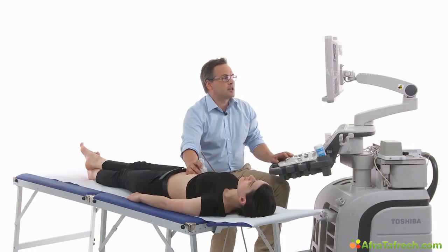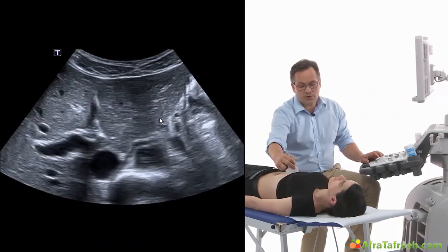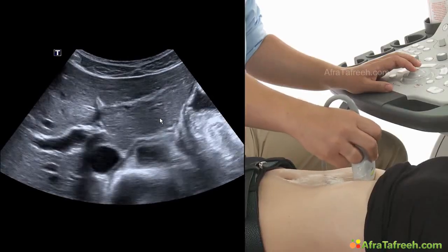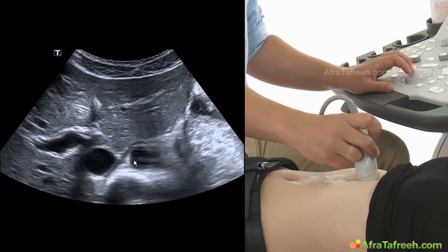After we manage to scan the aorta in the longitudinal scan, we change to the transverse view in the epigastrium, turning the probe 90 degrees counterclockwise, and we start to scan the aorta in a very superior region of the abdomen.